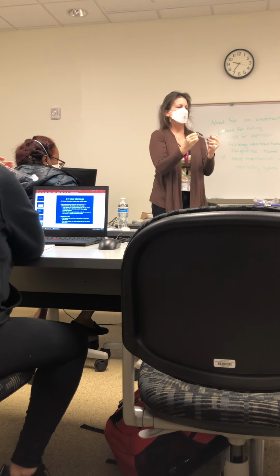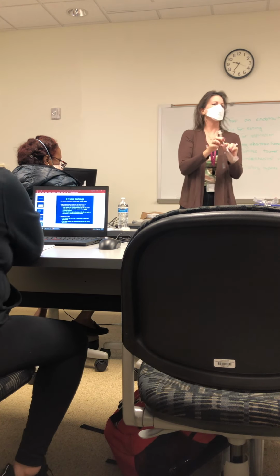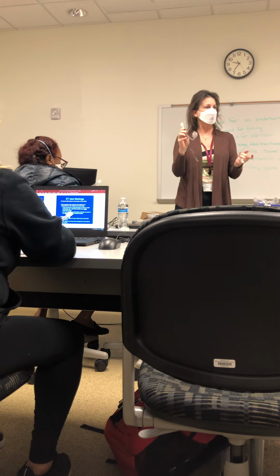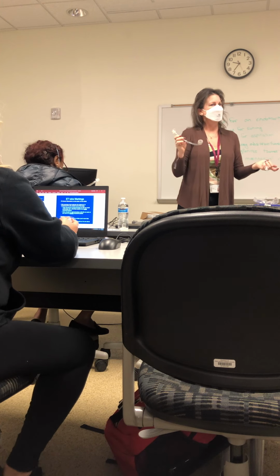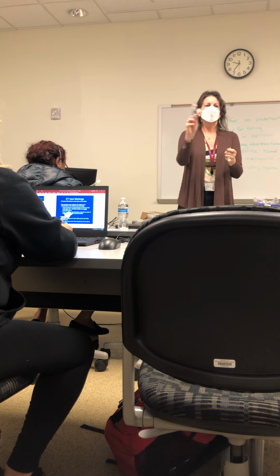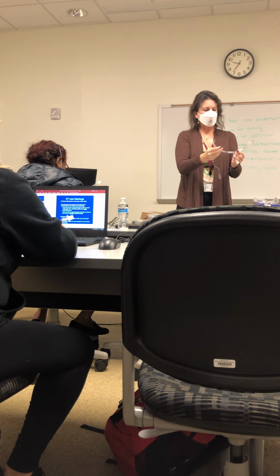Okay, so now we know our tube size, because when you're getting your ET tube ready to intubate, you're gonna have different sizes. So you gotta pick the size you think best fits. Usually, as I said, it's an 8. So we got our 8 ET tube. What size do you guys have? I got an 8. You both have 8s. Okay, what else do you see here?